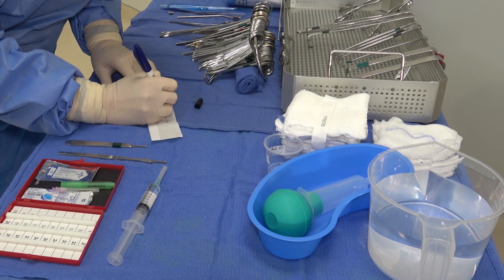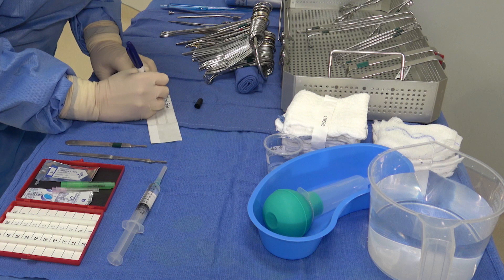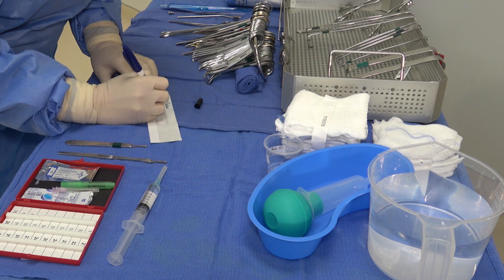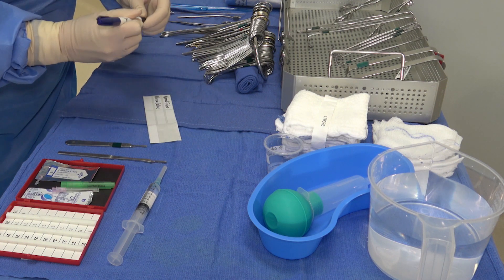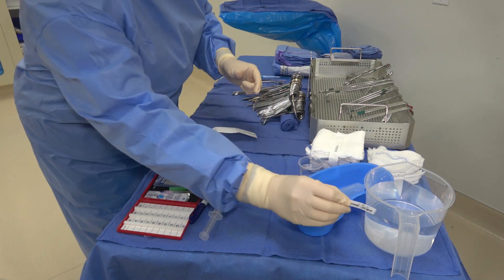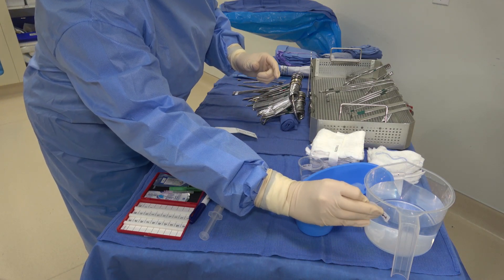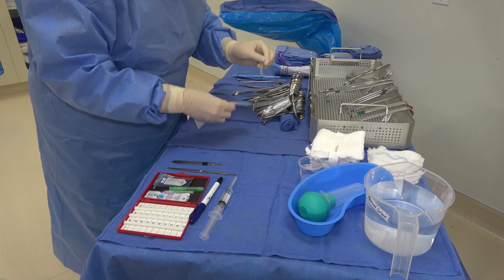Once the irrigation is on your field, you immediately label any container that may hold the irrigation — that usually means making two labels. You will use the black tip of your pen to write the labels, as the purple ink tends to smear easily and this defeats the purpose of the label. Place one label on your pitcher, taking care not to cover the increments on the side, and place the other label on your Acepto.